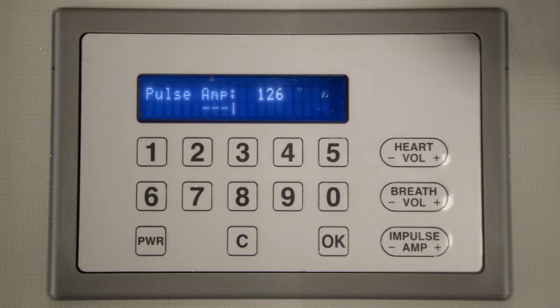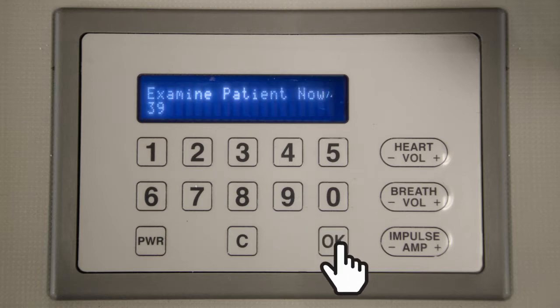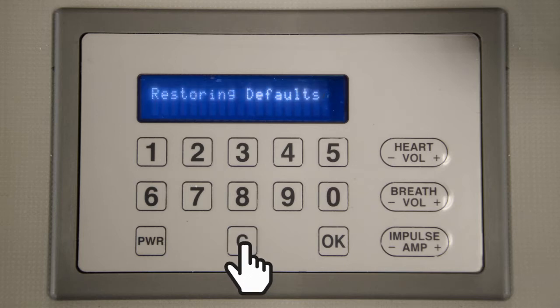To change Harvey's condition, simply input the desired code on the keypad and press OK. When changing to a new disease, the amplitude and volume settings will be automatically reset to preset levels. You can also return to preset levels by pressing the C button twice. Additionally, you can hide Harvey's condition number from the keypad by pressing the C button once.